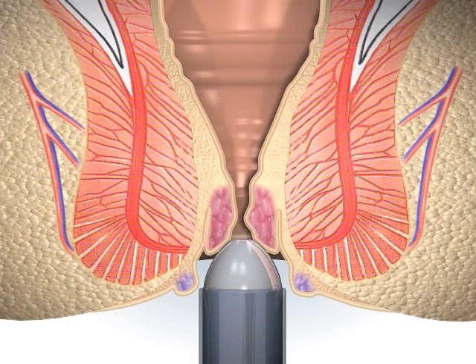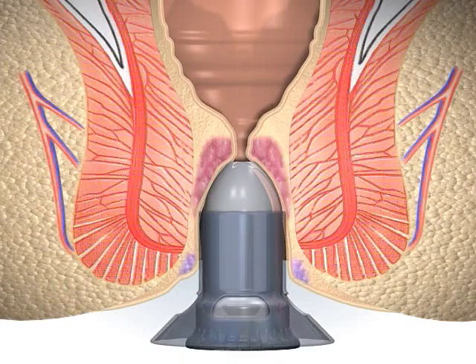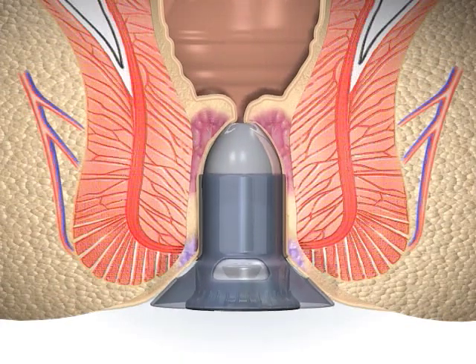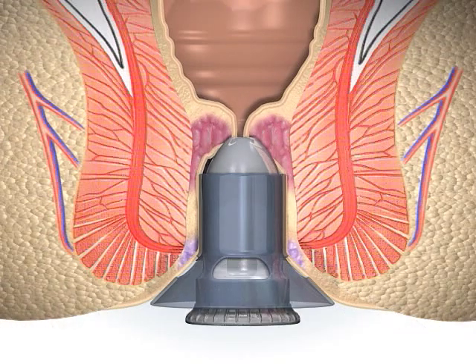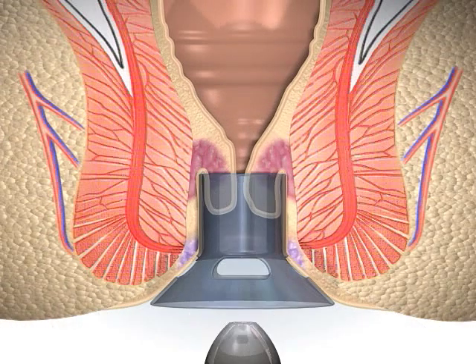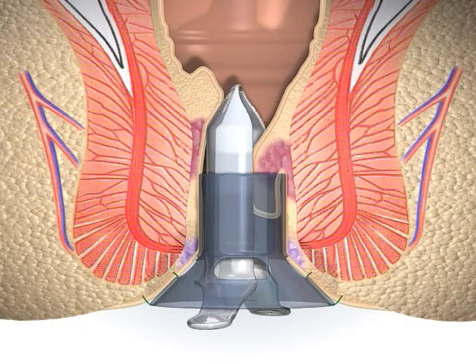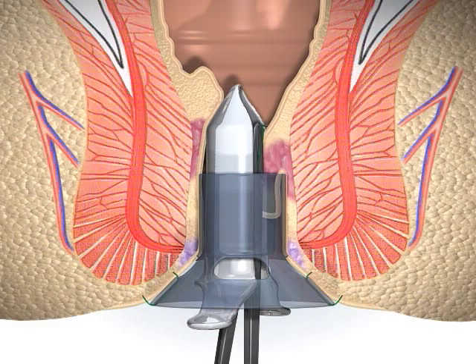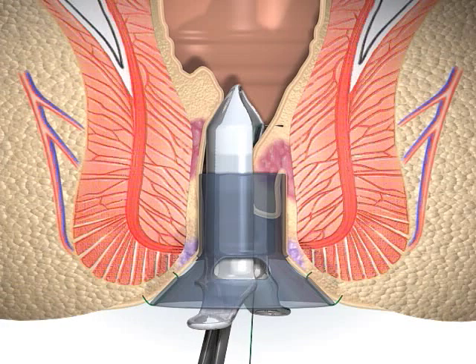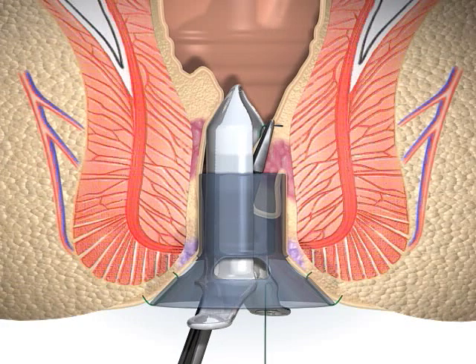The obturator is then removed, and the circular anal dilator with the obturator in place is inserted. The obturator is then removed. Rotating the anoscope while it is fully inserted in the circular anal dilator can twist the mucosa and cause an improper asymmetric purse string suture.